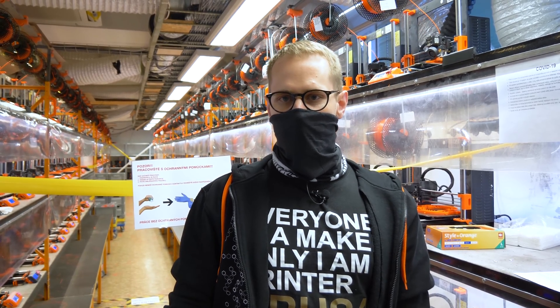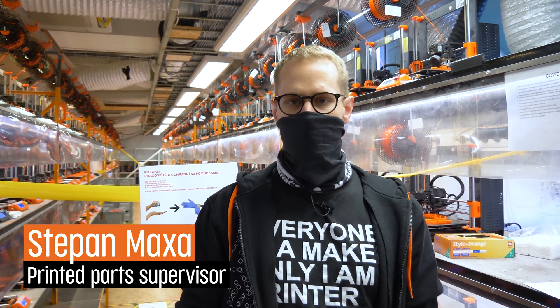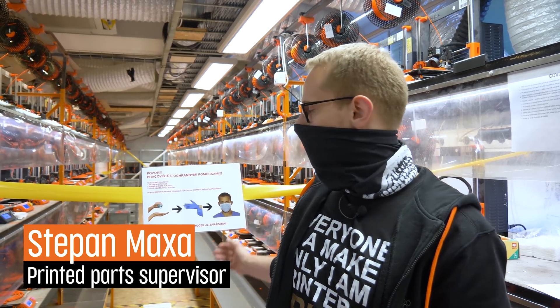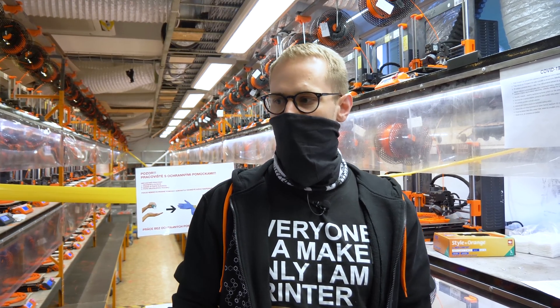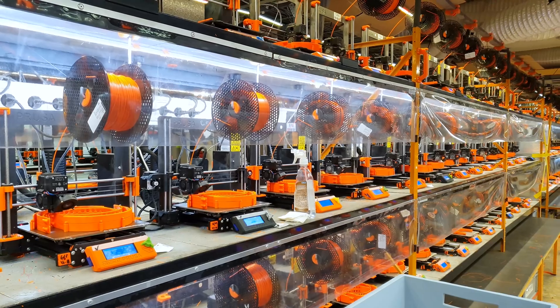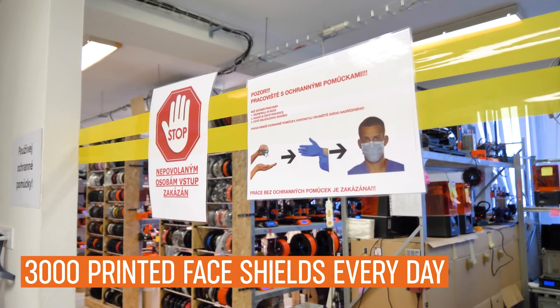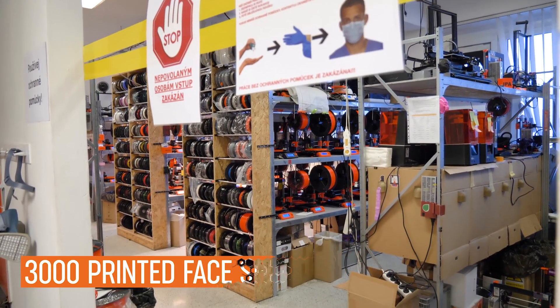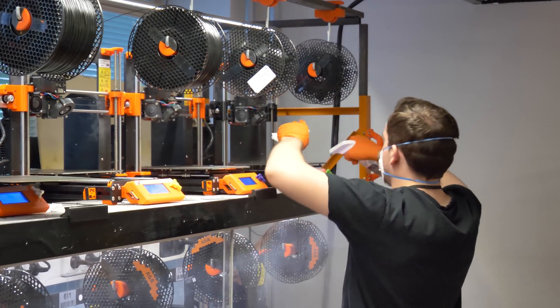Right now we are on the print farm where we have over 500 printers that normally print parts for other 3D printers, but now we have some printers dedicated to printing protective face shields. In the building we have two other smaller farms which we now also use to print face shields. This is a closed area which can only be entered by trained operators, who must always wear protective equipment.